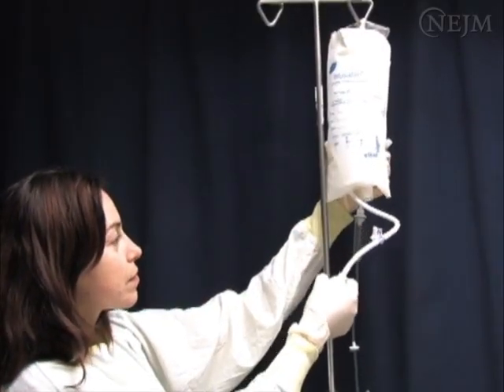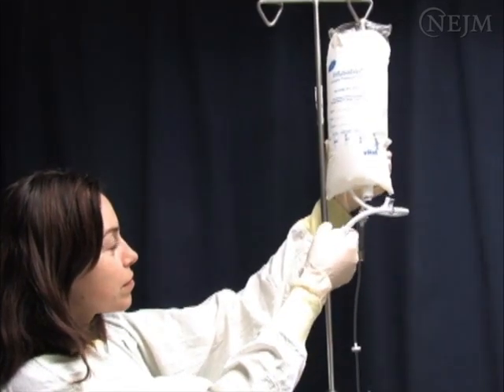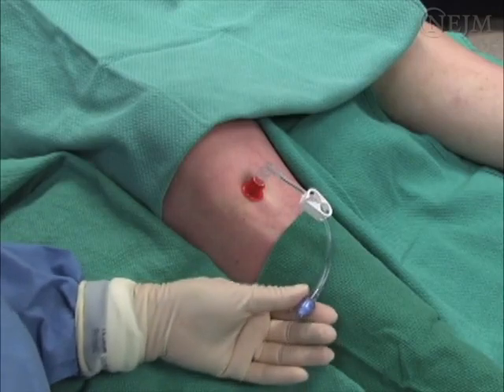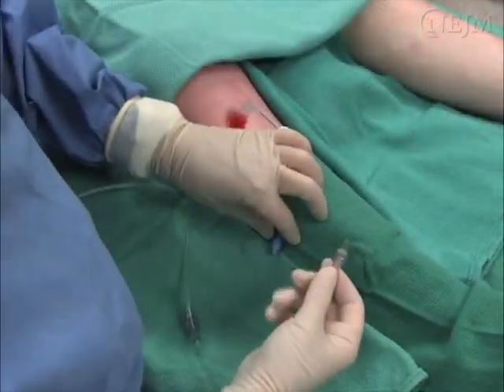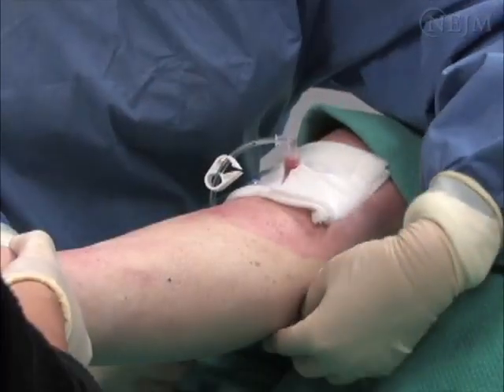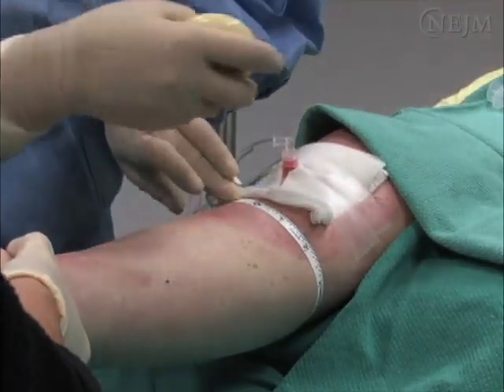A pressure bag should be used in patients requiring resuscitation once you are certain that the needle has been correctly placed and is functioning. If the patient is conscious, anesthetize the marrow cavity by infusing 20 to 40 milligrams of 1% lidocaine before initiating fluid infusion. While infusing fluids, watch carefully for extravasation and increased calf circumference.